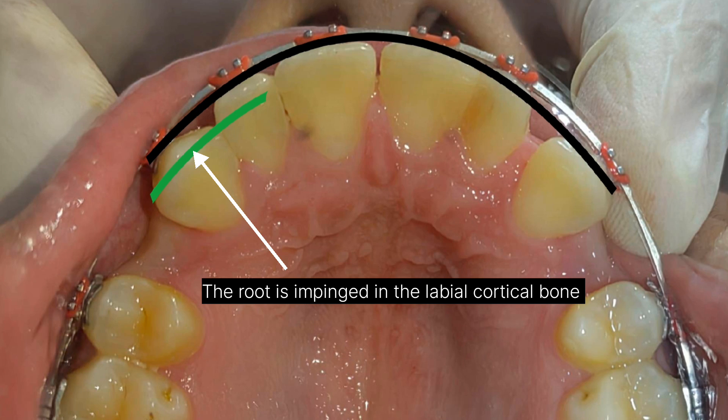I noticed that the extraction space started decreasing by posterior mesialization. The management here is introducing more positive torque to the root of this canine. There are different ways to do that.